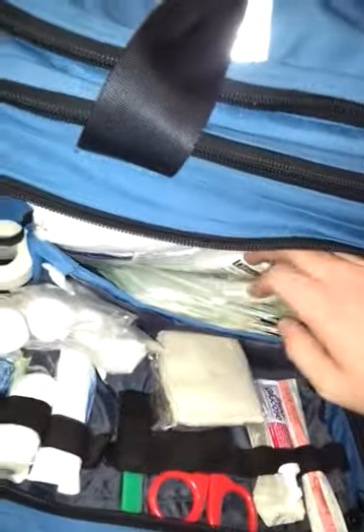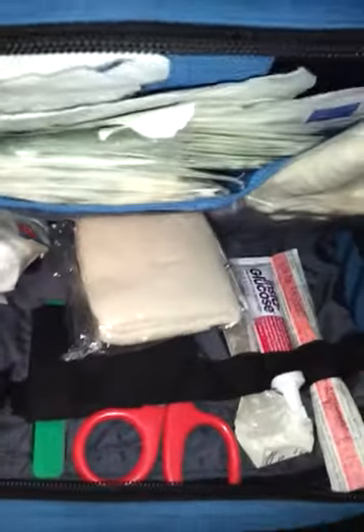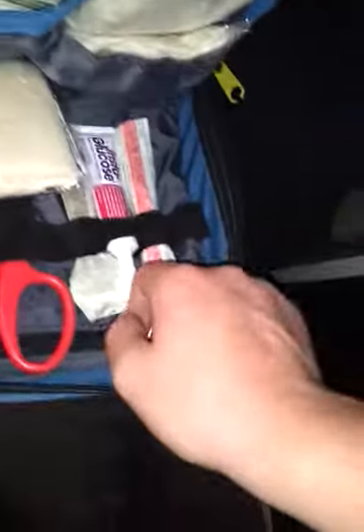Now in here is our bandaging compartment. You have 4x4s, 3x3s, 5x9s, triangular bandages, cling, bite stick, trauma scissors, and oral glucose.